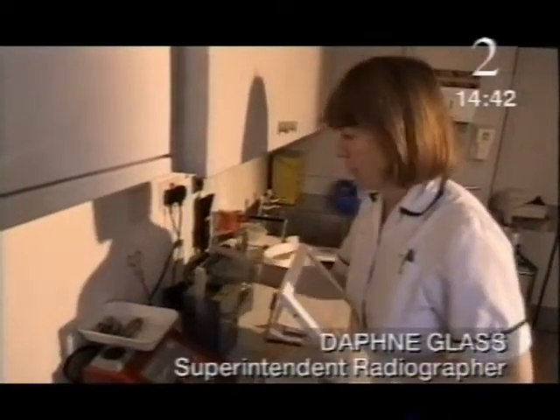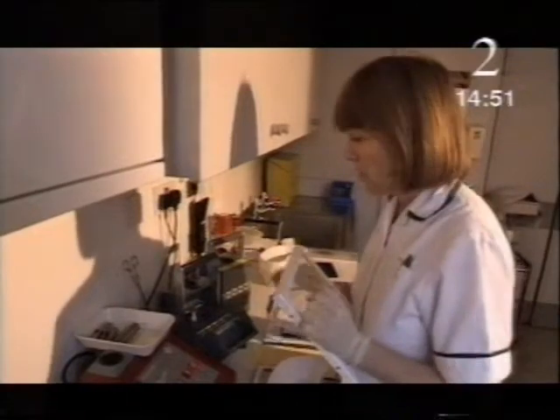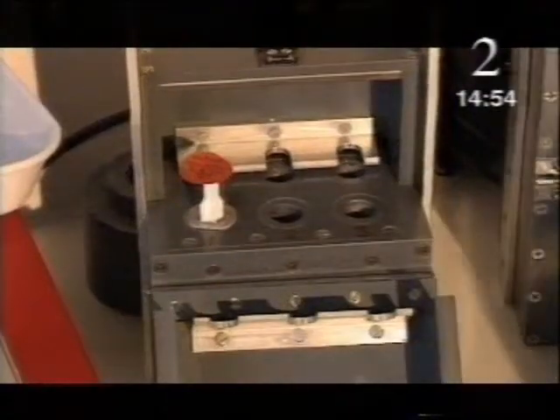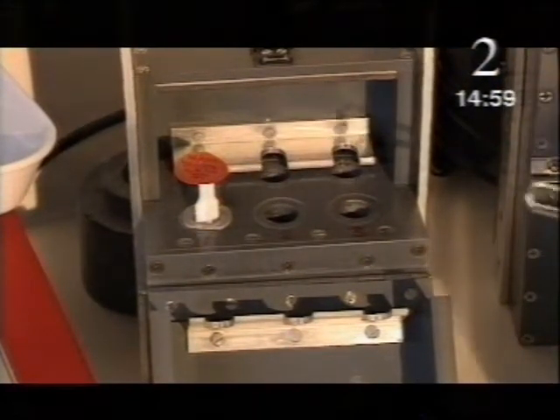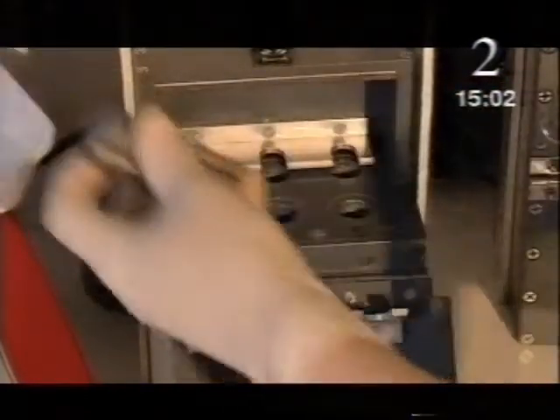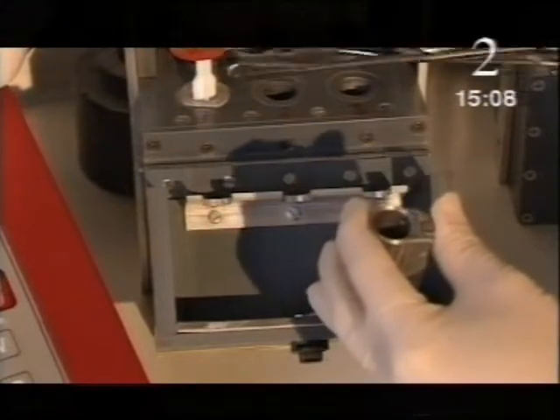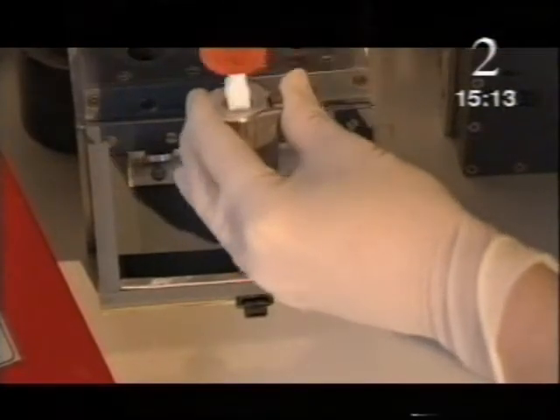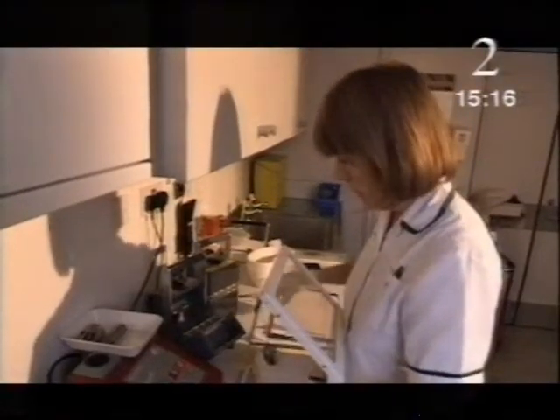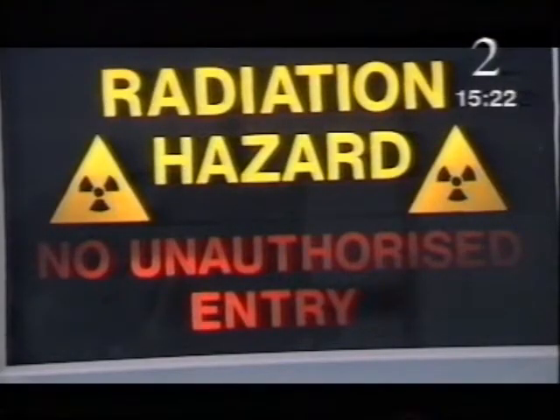Right, I've just been down to the radiopharmacy to collect these doses, and in this little lead box I have a syringe which has been pre-prepared for me with the dose which we need to give to Gavin. It has a protective shield around it in the carrying box, and I'm now going to put it into a syringe shield which has a little lead glass window so that the doctor can see that there is actually some fluid in the syringe, and this shield protects her against excessive radiation since she's giving injections day after day. Everything's ready. Daphne calls in a doctor to give the injection.